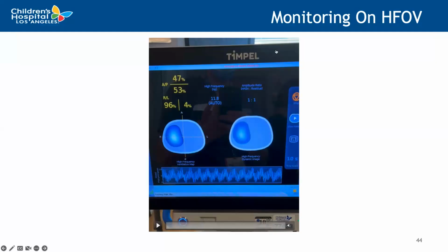And so again, when we're watching this video, areas that are lighter in color or white are areas that are more ventilated or would be potentially overdistended. Areas that are darker in color would be more collapsed or just have less ventilation. This particular patient, if it looks funny to you, actually had congenital absence of their left lung, and so they had a solitary right lung. And so I think it was even more important to monitor this patient with EIT, given that all of the ventilation was going to their solitary lung. And so I'll just play this video of what we see at the bedside.